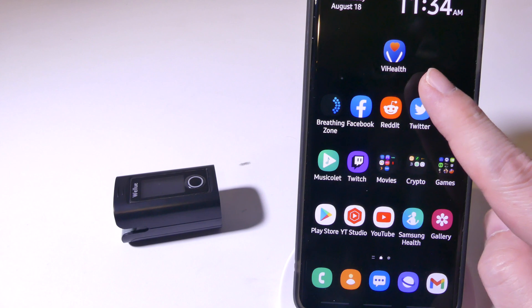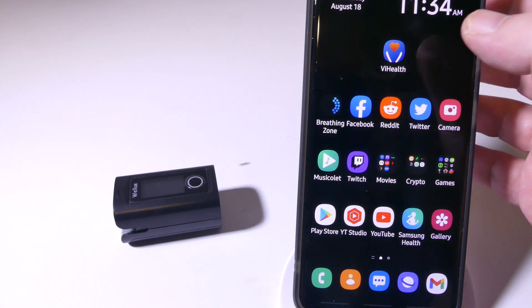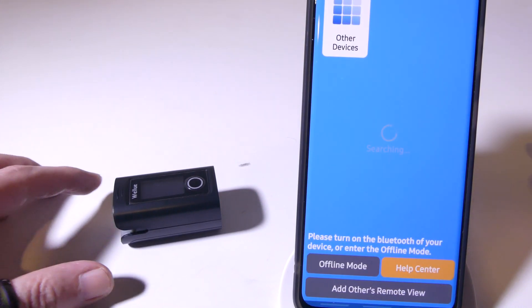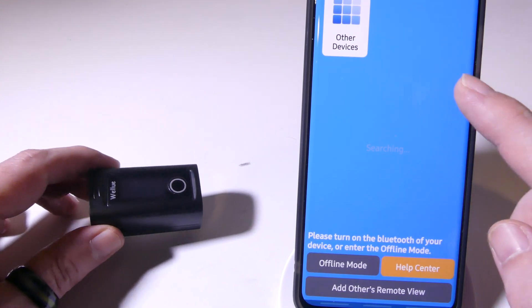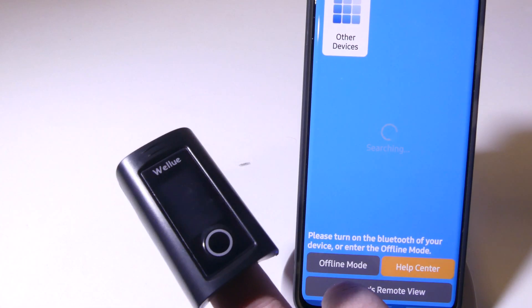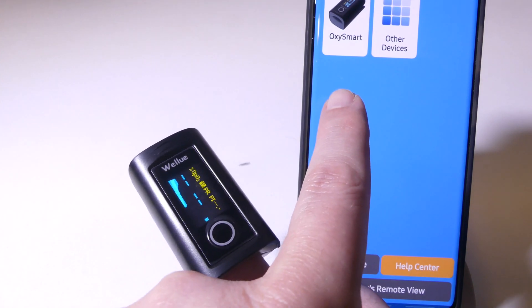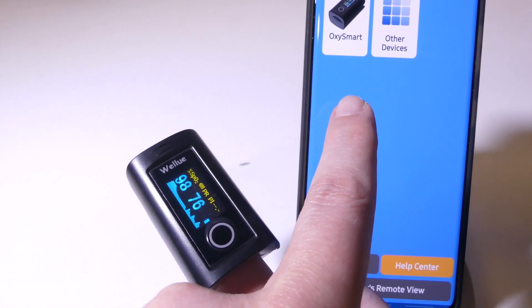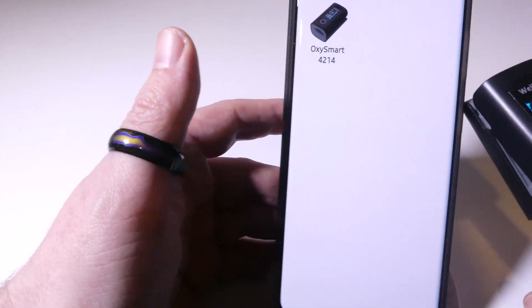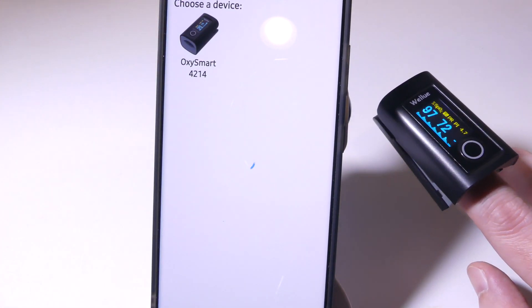Speaking of the app, it is called vHealth by WellU, and we're going to click on that. You can get this for iOS as well as Android — we're doing the Android side right now. It will come up searching for a device. You have to turn the device on by putting a finger in the end, and it'll come up in your list of devices. We'll click on the OxySmart — it will have a unique number after it — and it will connect.